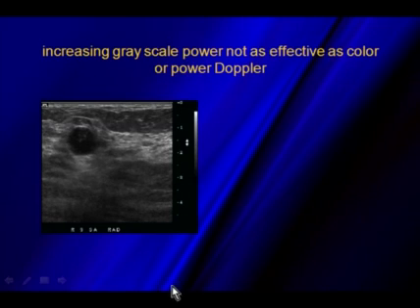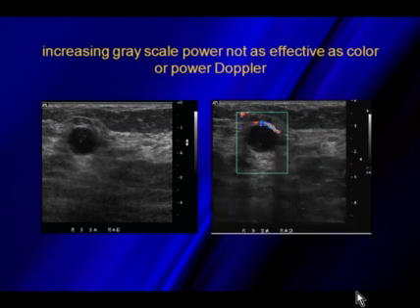Looking at this ultrasound image, you can see on this loop, it almost looks like we have a mural nodule located in this area. By turning on color Doppler, this just happens to be an artery going over the top. That's not hyperemia within the wall. If you notice here, we have a very thin echogenic cyst. But by turning on color Doppler, we can actually get these particles to start shifting, so we know it's not a true mural nodule, but there's actually some streaking going through there.